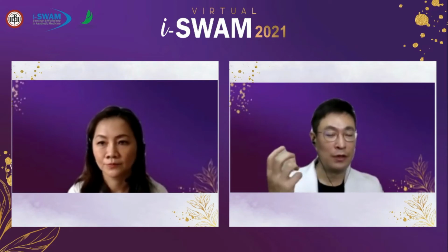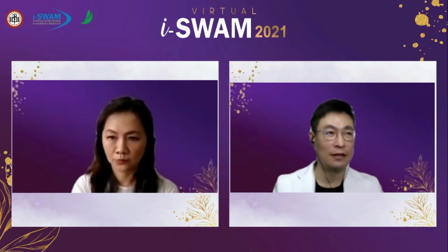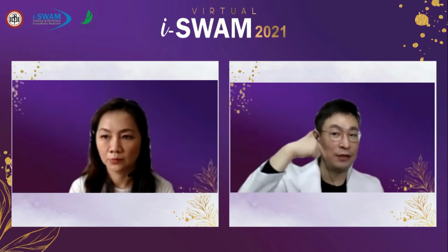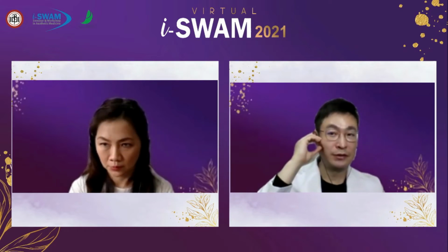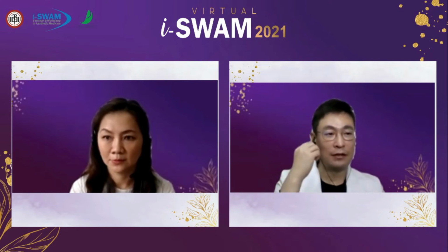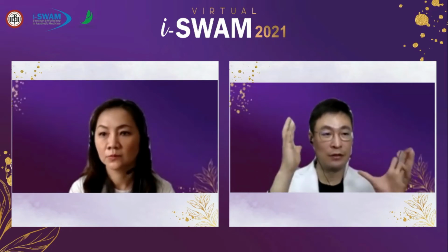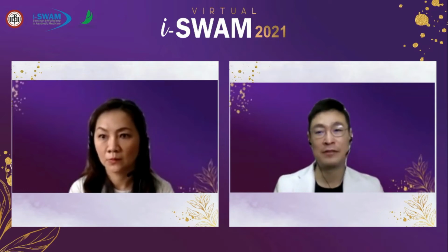Also, as we all know, the bidirectional cog thread is not, frankly speaking, lifting, it's repositioning or pinching the skin. So if you put too much thread here, there may be a bulging in the middle. So if you also put the temporal lifting, then you will have some effect of sharing the pinching like this. So the result will be more natural and more effective by combining two methods.